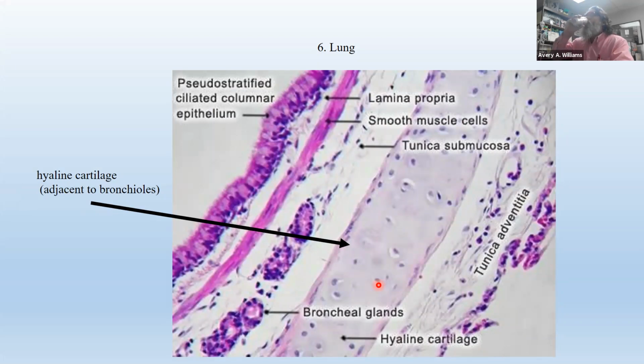Now, inside the lung, of course, you're going to find pieces of cartilage. And the cartilage supplies the skeletal element for the bronchioles, the internal structural support holding the bronchioles open. But it's not elastic cartilage. And there are 3 different types of cartilage: elastic, hyaline, and fibrocartilage.